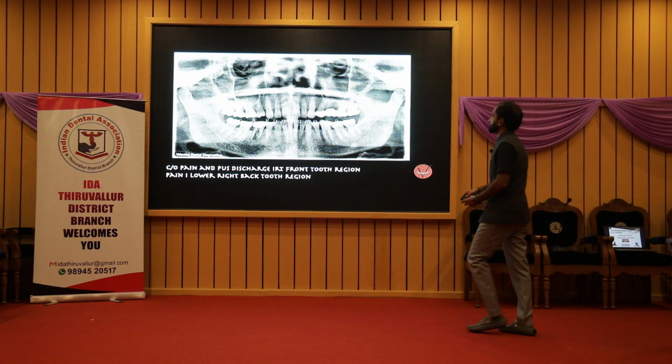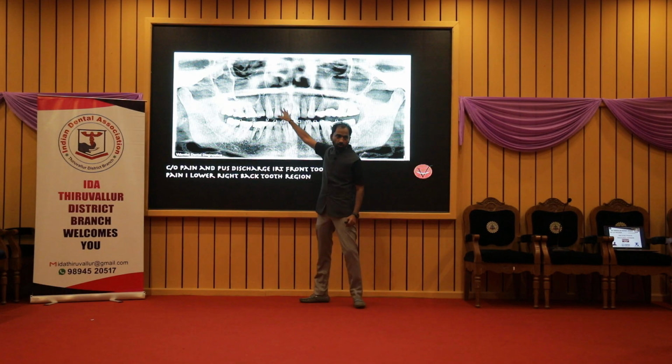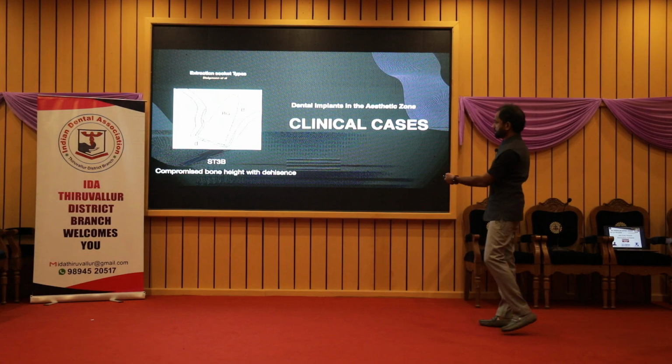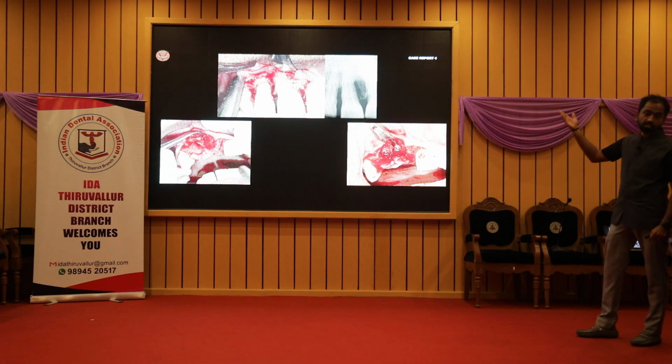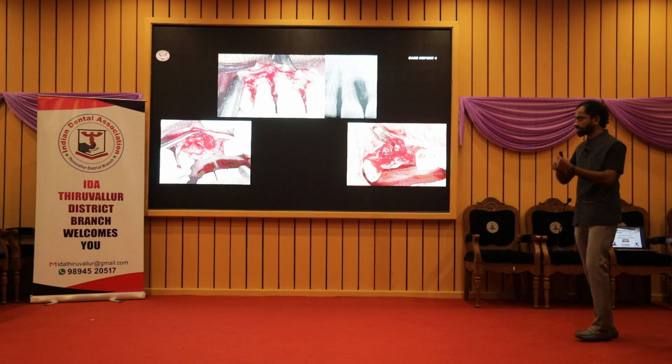Again, the next case. Yeah, next case, all these two. This is not very clear because it is too bright. All these areas have a lot of bone loss. It is like an ST3 case. Yeah, I think ST3 means a lot of labial bone is gone. Okay, for this patient, can you see that? A lot. I have a video of this, but I didn't put it because it's a little long.